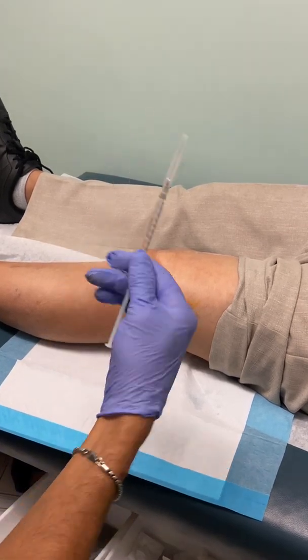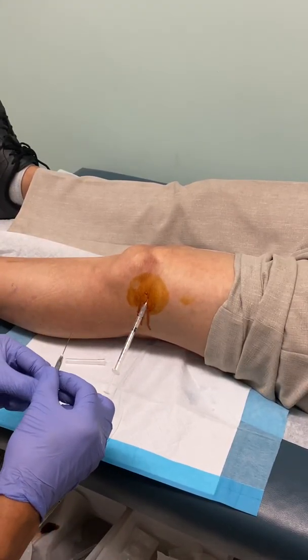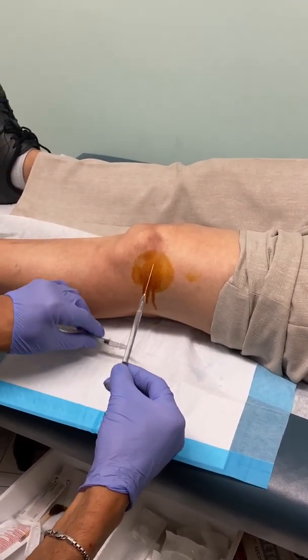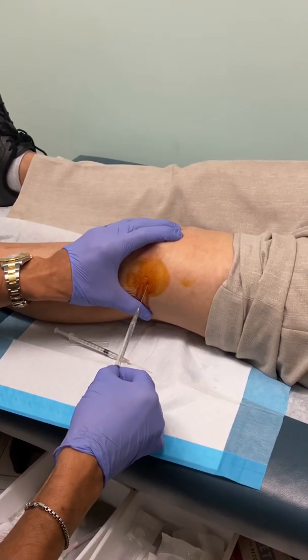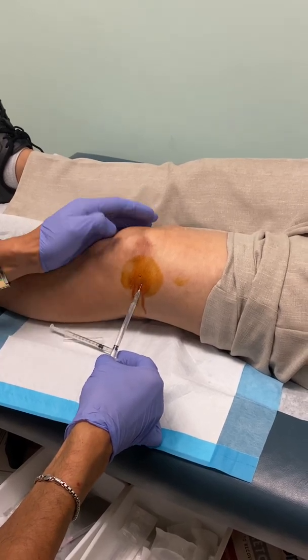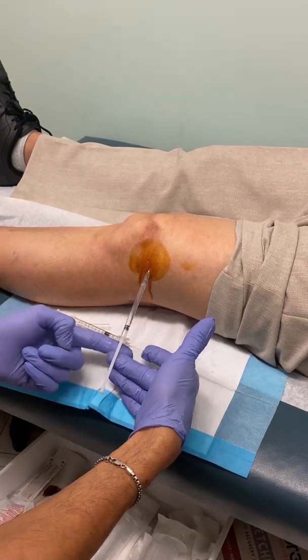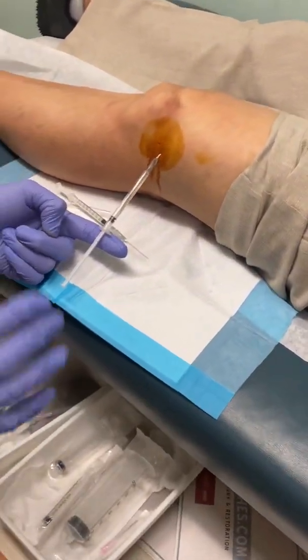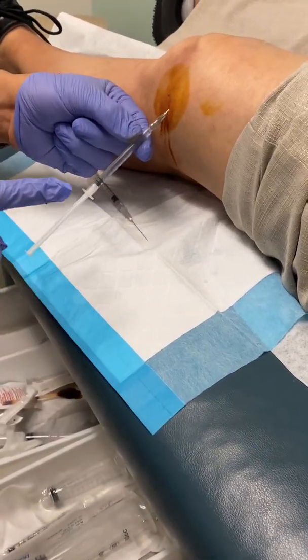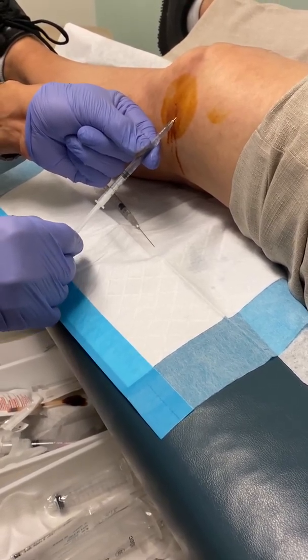So that's my 22 gauge needle. And once again, I'm going to make sure that I'm in, especially in this particular case where they had a hard time previously. So I'm going to keep an eye on the ball, the same trajectory. See the angle like that — it has to be like that. If I go in like this, I'm going to hit either the... because that feels really nice.